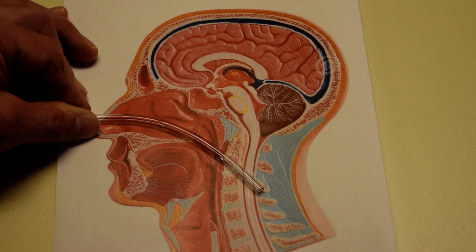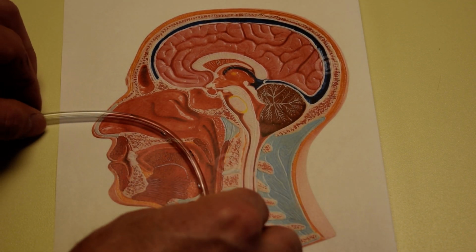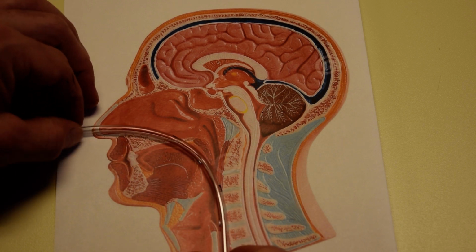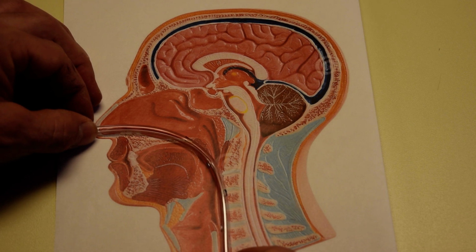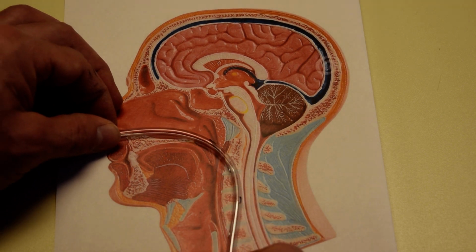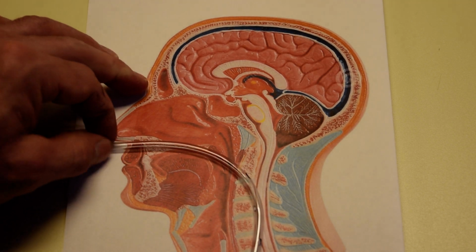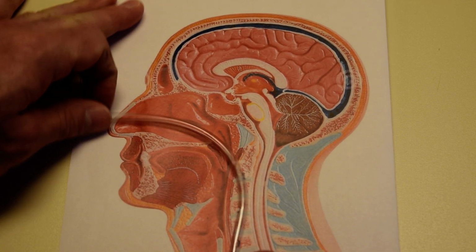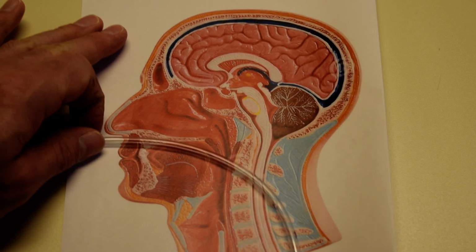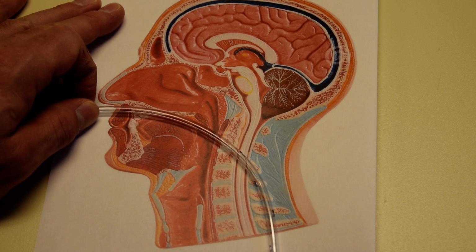So the next step will be, okay, I'm now going to move the tube forward, and I want you to feel for it. If you choose that water is a good plan, then say, once you feel that you want to swallow it with a sip of water, just a sip. And you get the patient to swallow a sip of water and see if they can get the tube down. Once you've gotten down a good 5 to 10 centimeters from the nose, you are probably exactly in the right pathway that you want to be. At this point, again, I recommend stopping and checking in with your patient. How does it feel? Are you okay?